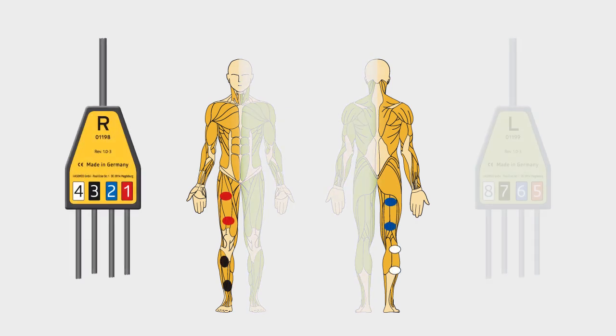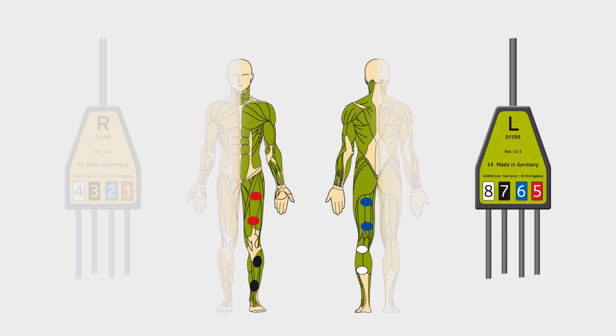The Hasamed cables and electrode connectors themselves are color-coded to match. This makes the application and allocation of the electrodes very easy, and it saves time.